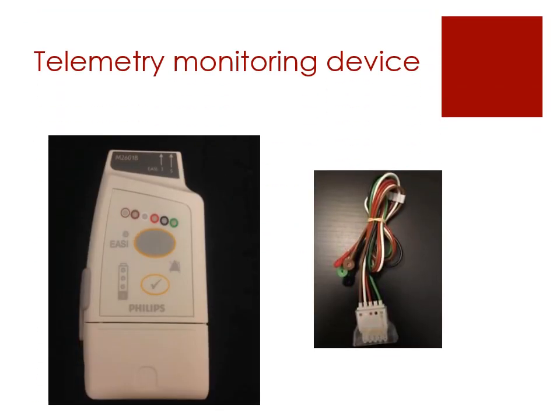Here are our telemetry monitors that we use across the way at the medical center, and these are typical ones, and you can see how the leads are color coded. The leads are usually very long, so that you can put it in the pocket and you don't have to worry about having them short and the leads clicking off.